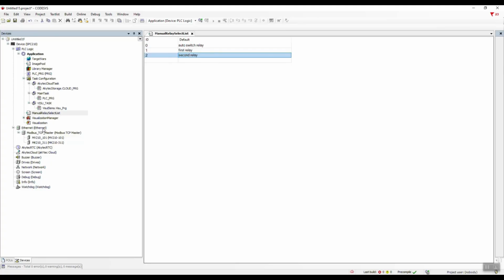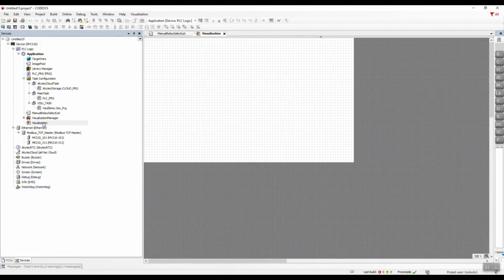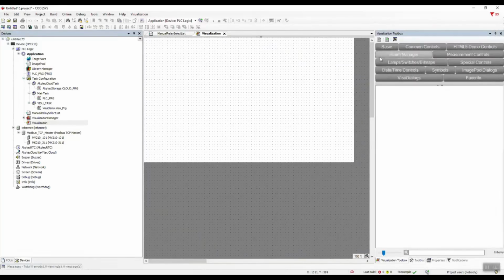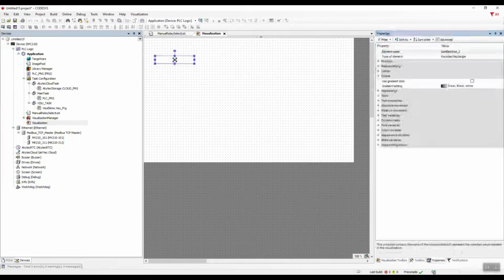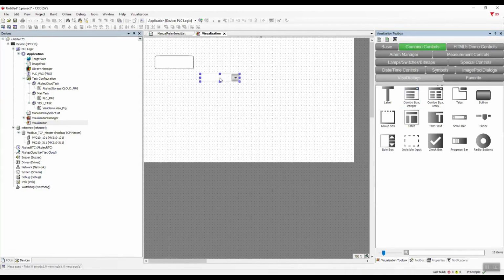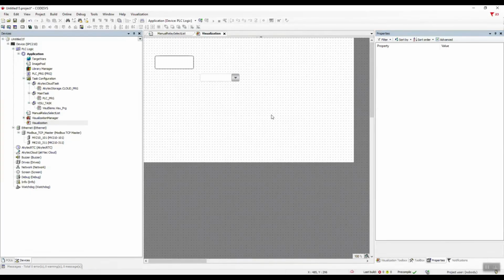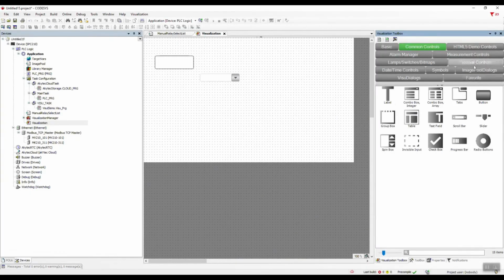Step 5. Click on Visualization in the device tree, and you'll automatically go to the Visualization Editor, where, for the sterilizer settings, we add the required number of rounded rectangles to the screen. Next, add the ComboBox integer component and in its settings, specify the text list we created. Then add the power switch and lamp components.